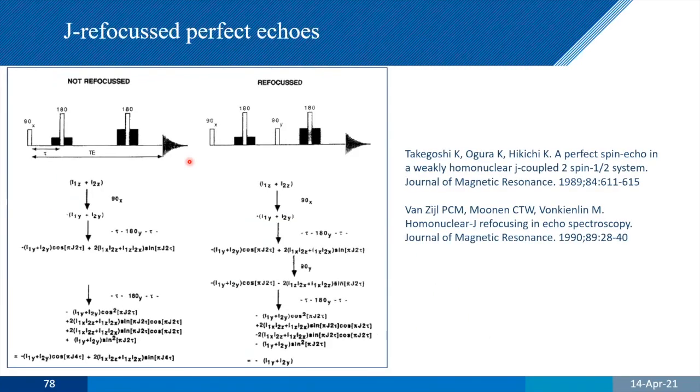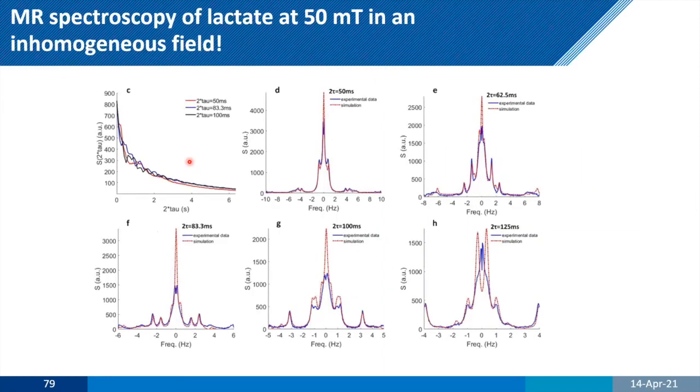So what we can do is go back to some old ideas in terms of perfect echoes and J refocusing. Essentially, if you consider a CPMG train and look at that signal decay, it's going to be modulated by T2, not T2 star. And it's also going to be modulated by this strong coupling. If you look at that decay and Fourier transform it, and look at our frequency axis down here, you can see we have sub-hertz resolution. If you look at lactic acid, with a simulated spectrum and the real spectrum here, we can see we've got very good agreement. So you can potentially pick up lactic acid spectroscopically here in a very, very inhomogeneous field.